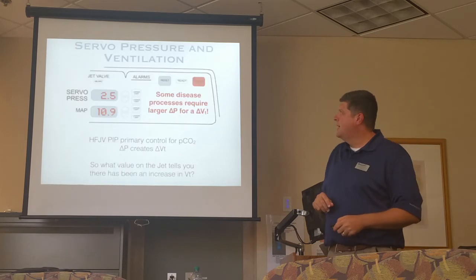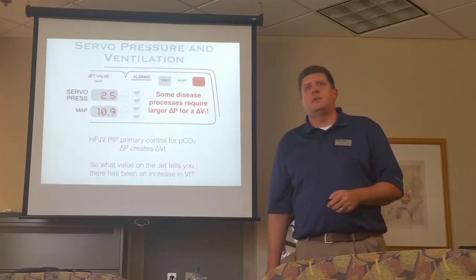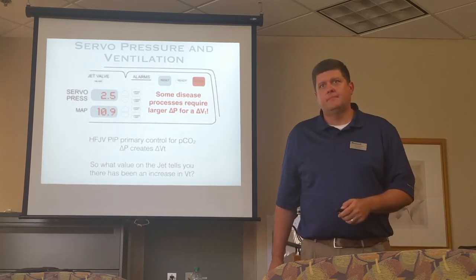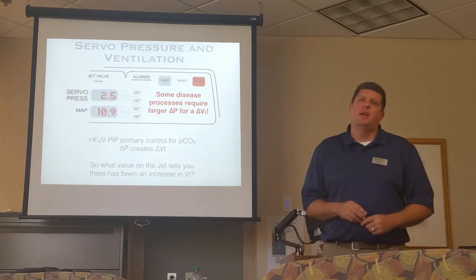Right? I have a question. Yes, sir. How much change in servo pressure should we see over a 12-hour shift before considering making changes? I mean, if we see a change of about, you know, from maybe 1.8 to maybe up as high as into the 4 range, 4.2. Yeah, that's probably too much there.